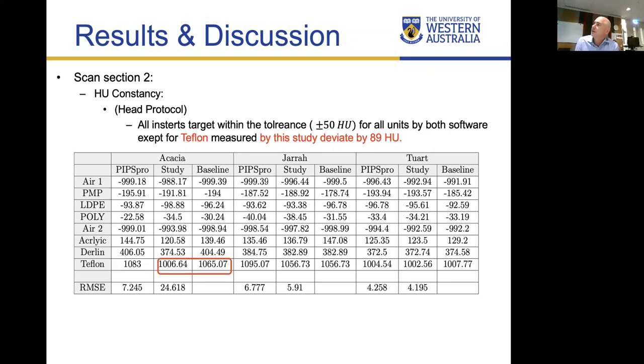Thanks, Ghazi. I was just going to ask about the differences between the cone beam systems. They're all from the same manufacturer, so what would cause differences from one cone beam system to the next? You mean from one unit to another unit? Yes. Every unit's stability is different from other units. With time, the stability of the unit degrades from what was established as the baseline at commissioning time. So there is absolutely a different baseline value for each unit and each protocol.